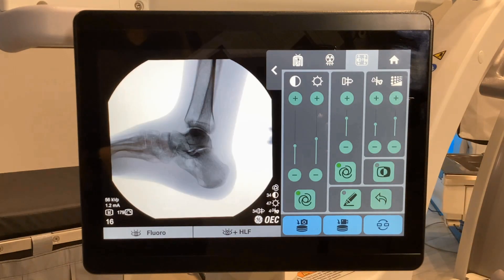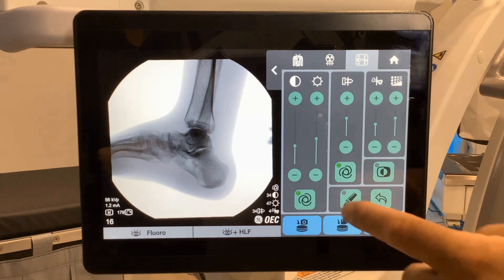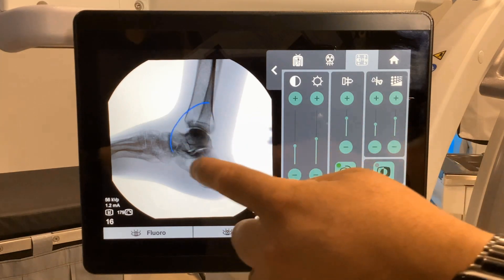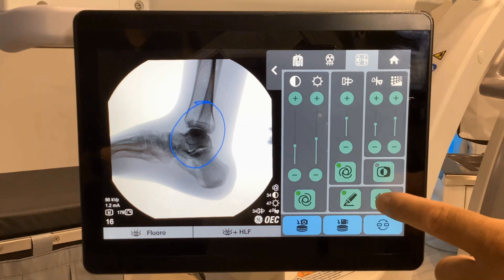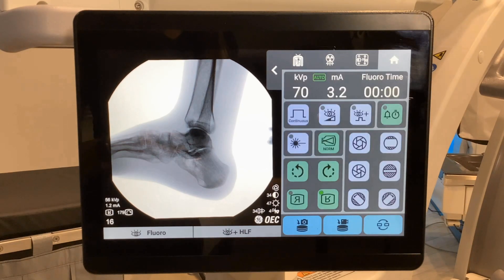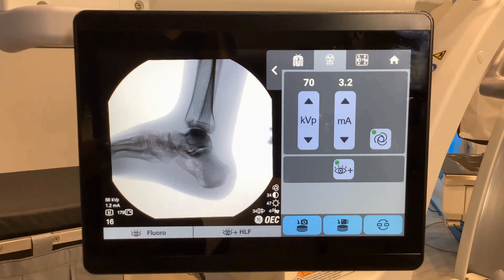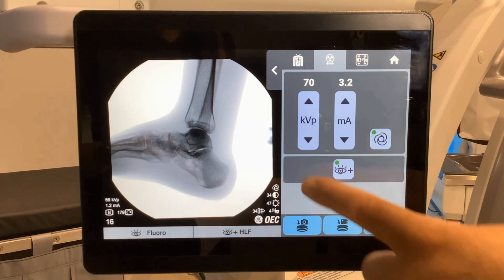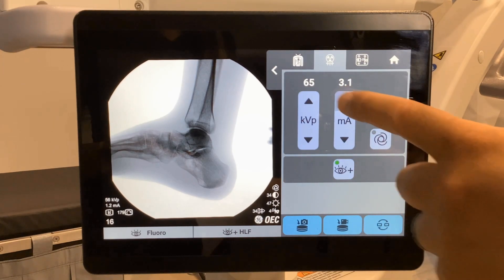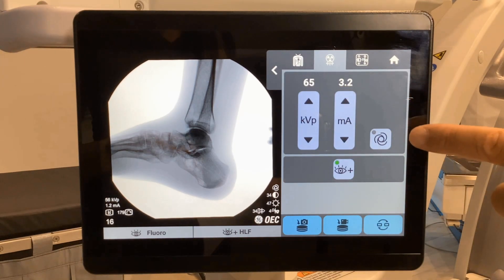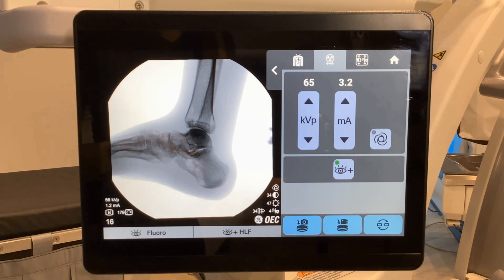Negate. Digital pen. Markings will stay on screen during live fluoroscopy. Use the arrow to remove. Technical factors: adjust your KV or MA as desired. Once adjusted, please notice automatic has been turned off. To re-engage, touch automatic.